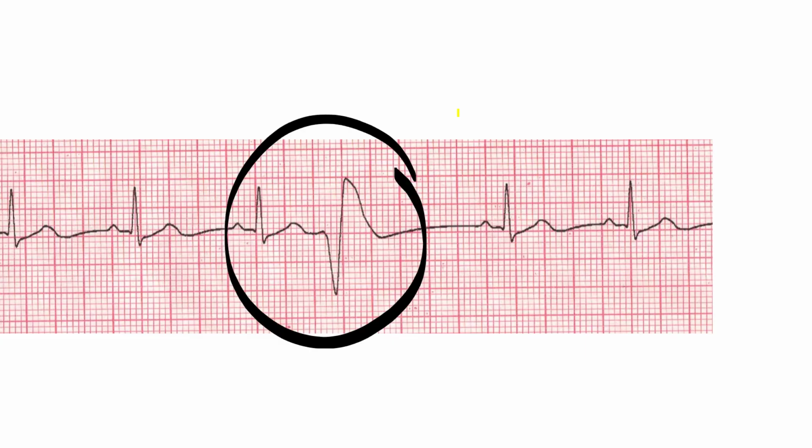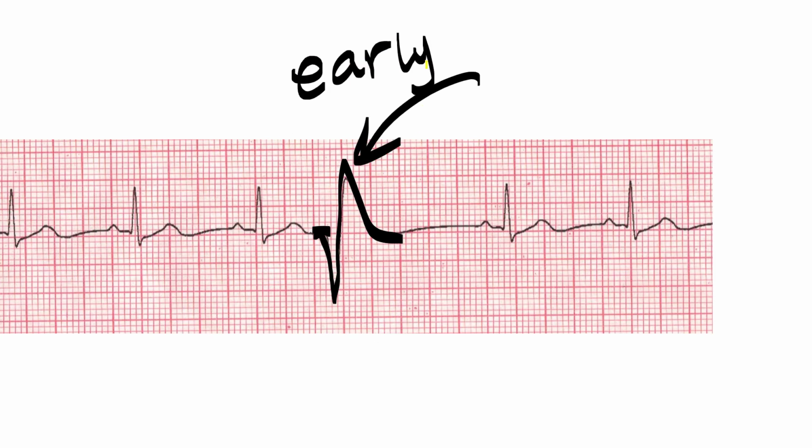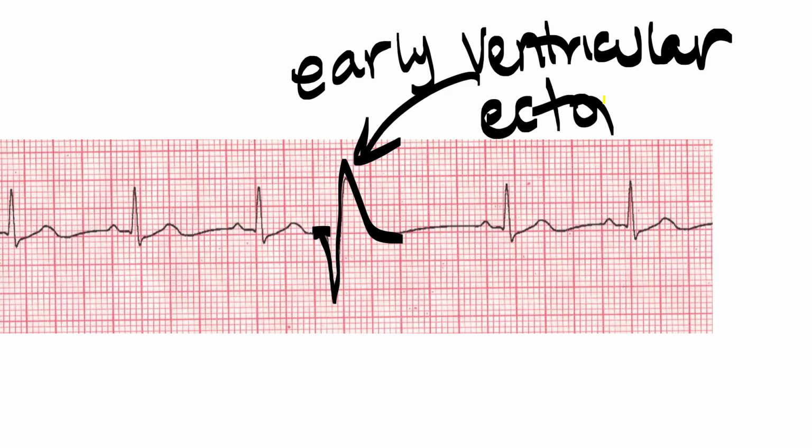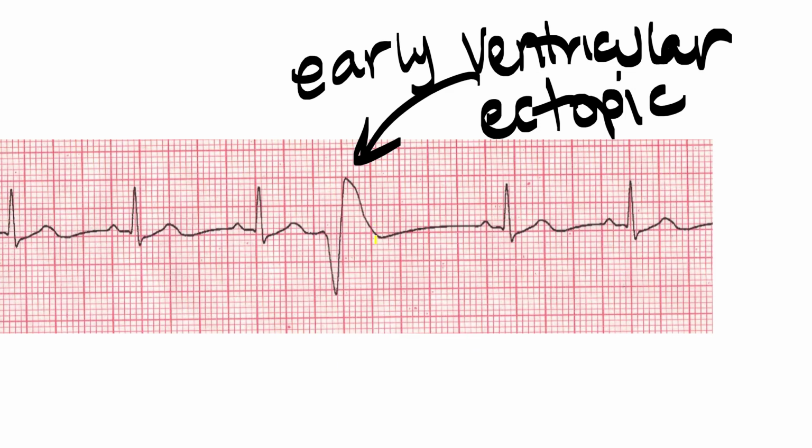Just one more thing that we commonly see in class are these random ventricular beats. This is an early depolarization by a group of ventricular myocytes that causes the ventricles to have an early excitation, and sometimes you'll hear that called a premature ventricular contraction, in quotes, because we can't see the contraction.